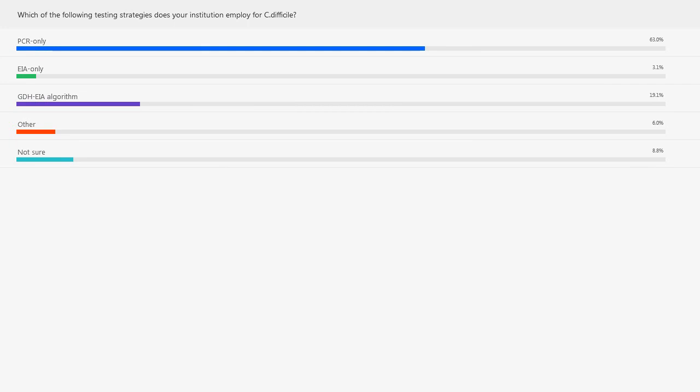Well, thank you, Zach. And good afternoon to all of you in the East, and good morning to all of you in the West. As our poll indicates, one of the areas that we've seen a great deal of movement over the last several years is the movement from EIA-based testing to PCR-based testing for the diagnosis of C. difficile. For those of us that perform PCR only in our laboratories, there have been significant new challenges or significant discussion around the utility of PCR, particularly around the specificity. And 2018 has really been no exception to this process.